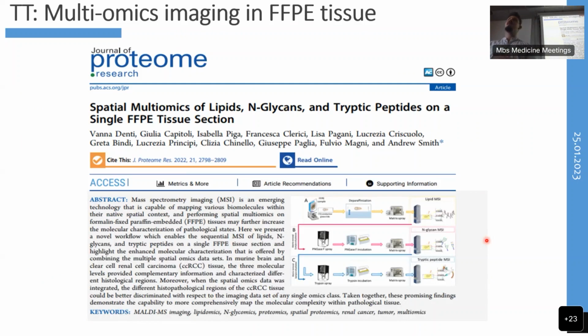It is particularly important that we're able to do this on a single tissue section, because from time to time, with certain rare diseases, diagnostic material is quite scant. In an instance where we might have heterogeneous populations of lymphocytes within that tissue, there are differences in sequential tissue sections. So we set up this workflow to be able to do it all on a single tissue section.